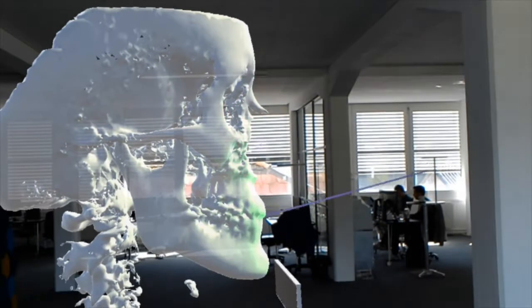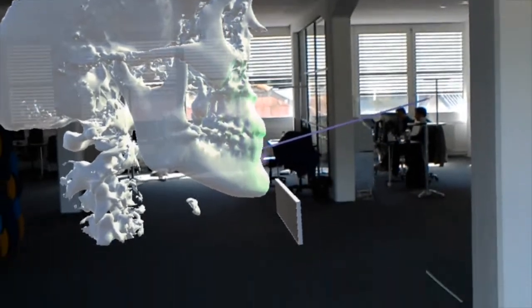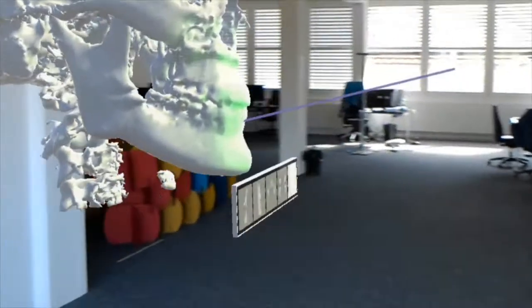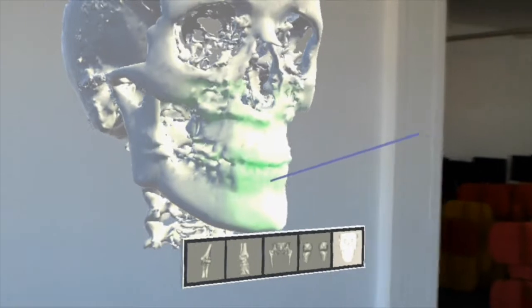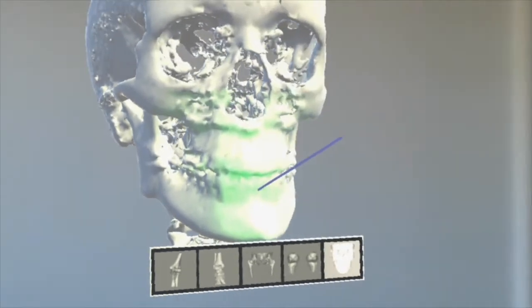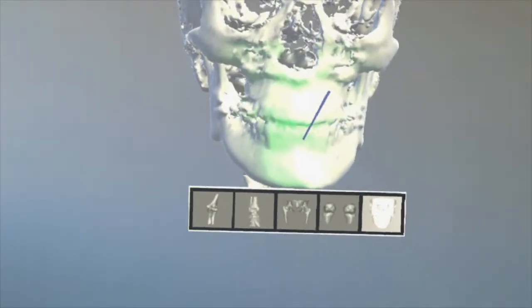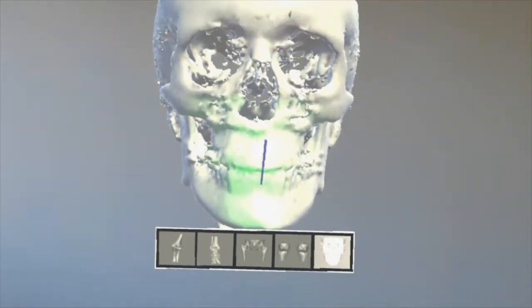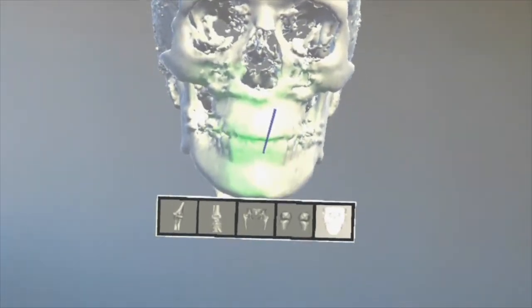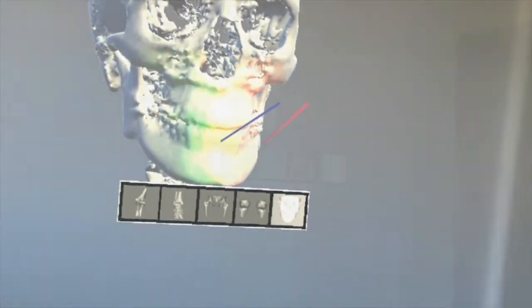We enable the user to interact with the displayed model in several ways. Interesting parts of the structure can be highlighted and the model is zoomable.